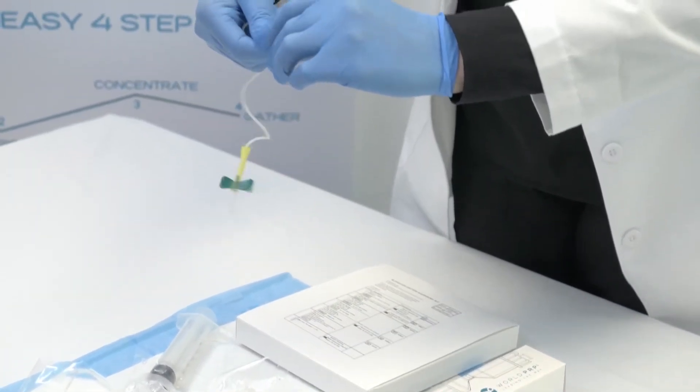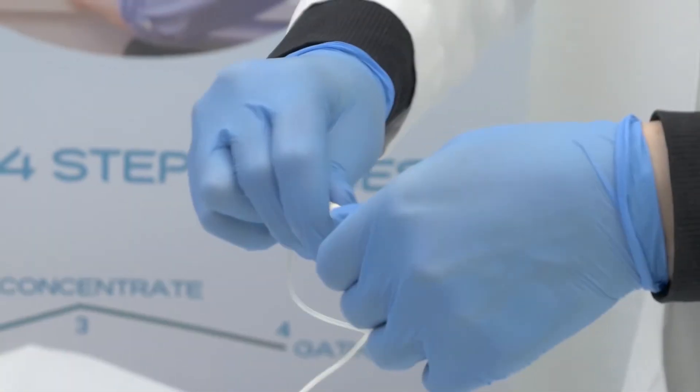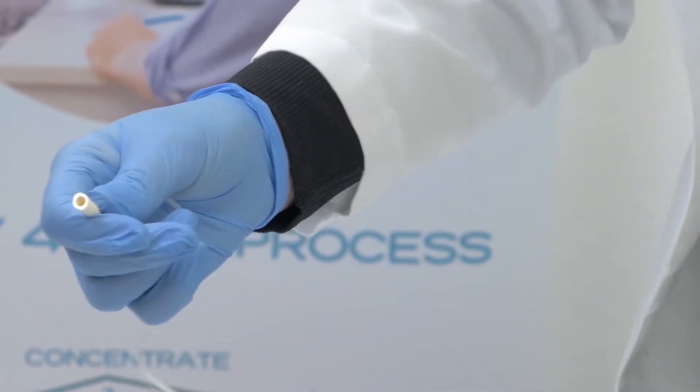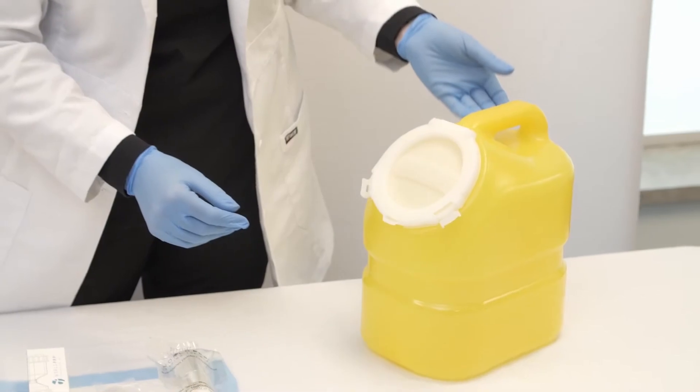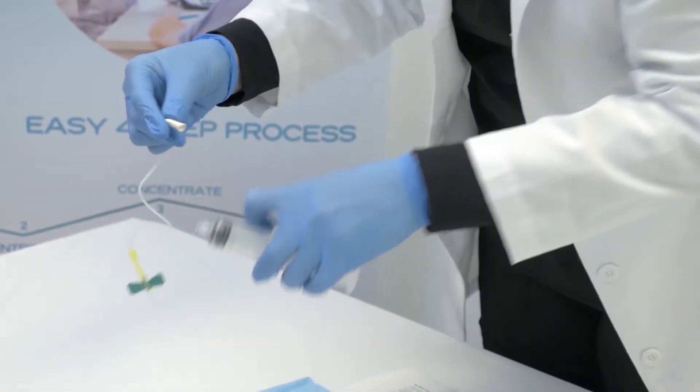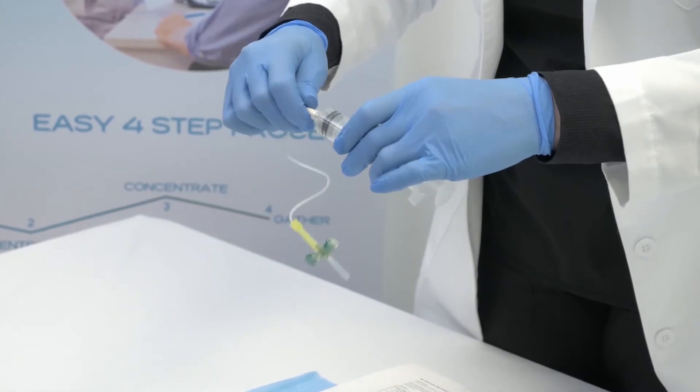Next, take the butterfly blood collection set and pull away the dark grey tip. Be careful as there is a needle within the dark grey tip. Place into the sharps container. Attach the butterfly needle to the 30 ml syringe.